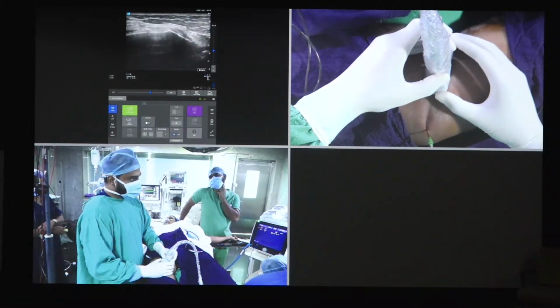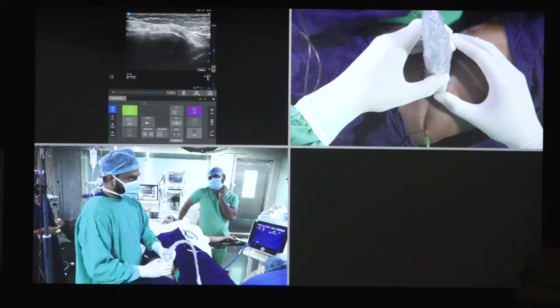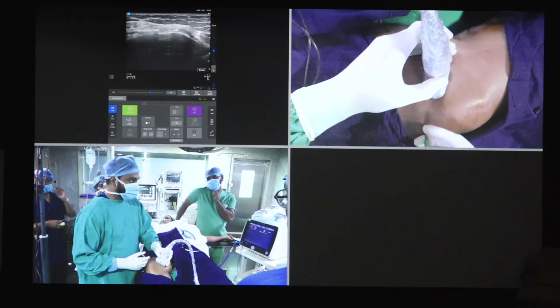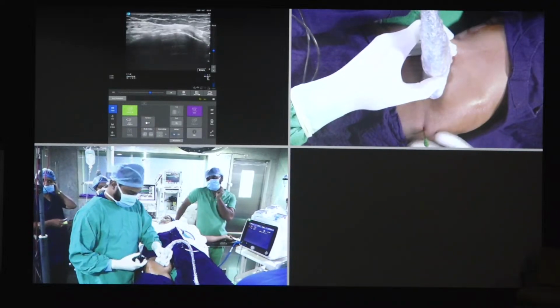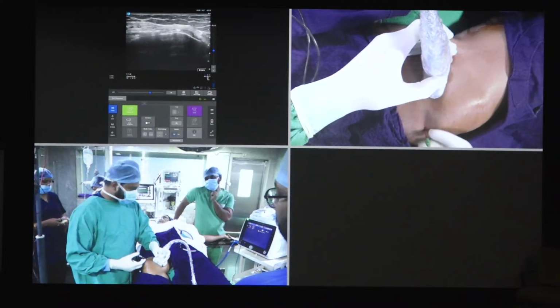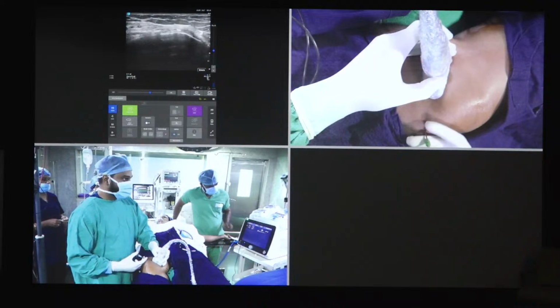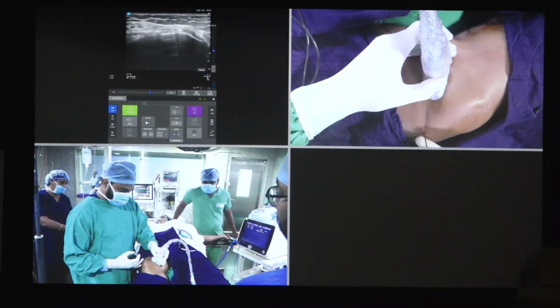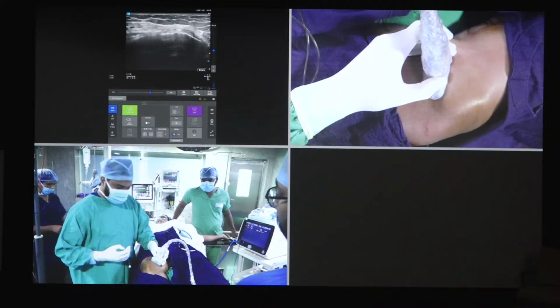So basically that is also the genicular artery along with that. So we need to target that, and usually I use the same needle insertion, but for her, this is a 7.5 needle, so we need to take another point for her.